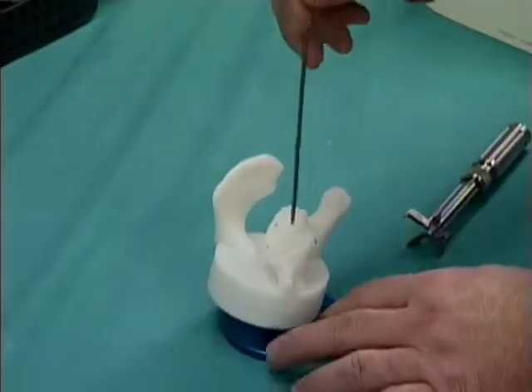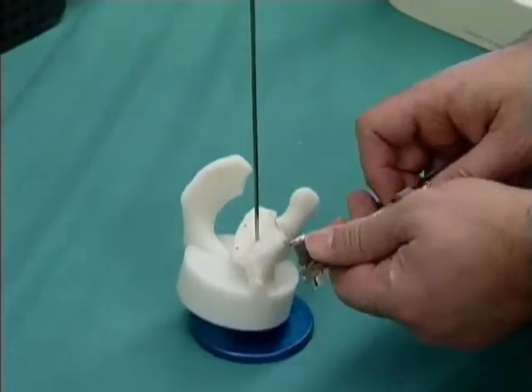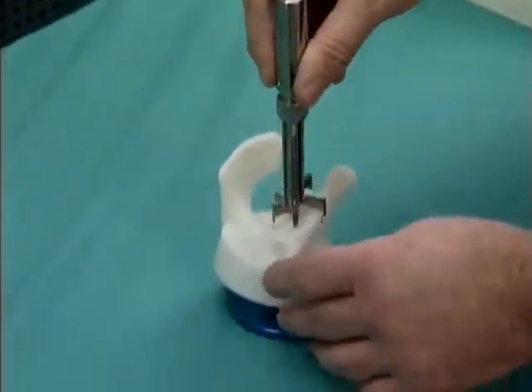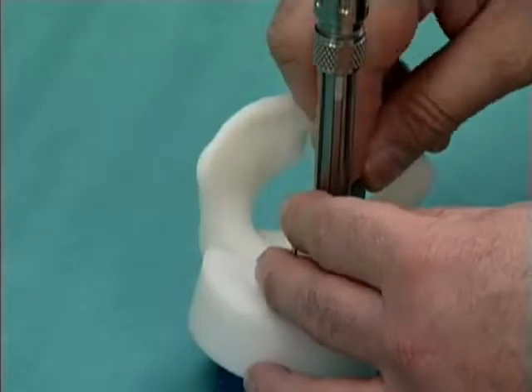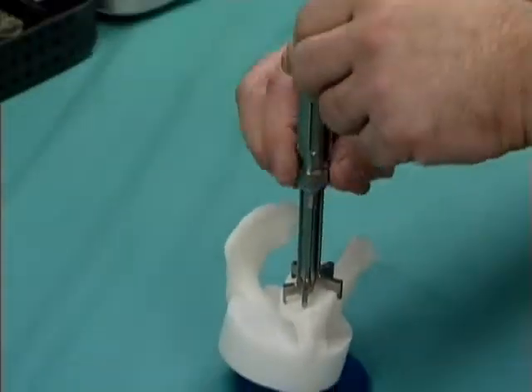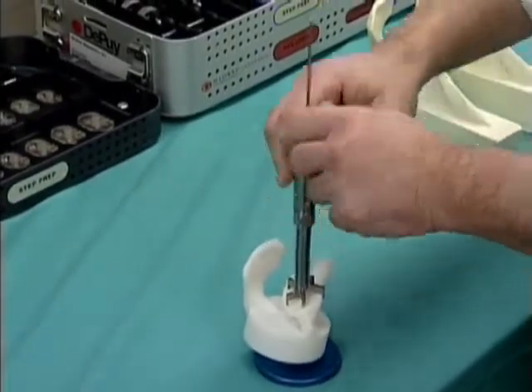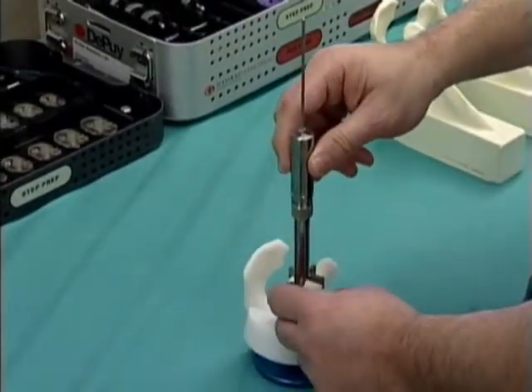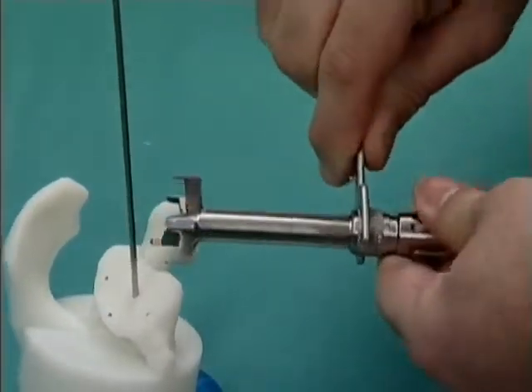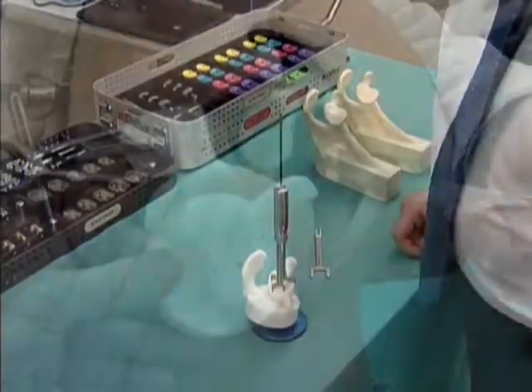The model of the bone is represented here as a plastic model with the guide pin placed in the correct location for correction of glenoid version. An adjustable instrument with adjustable legs is placed over the model and adjusted so that it registers the location of the guide pin relevant to the bony morphology. The collet is then tightened and the device is checked.